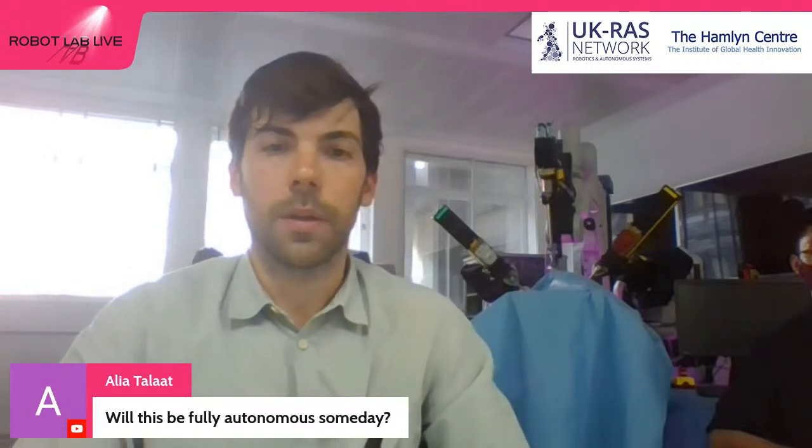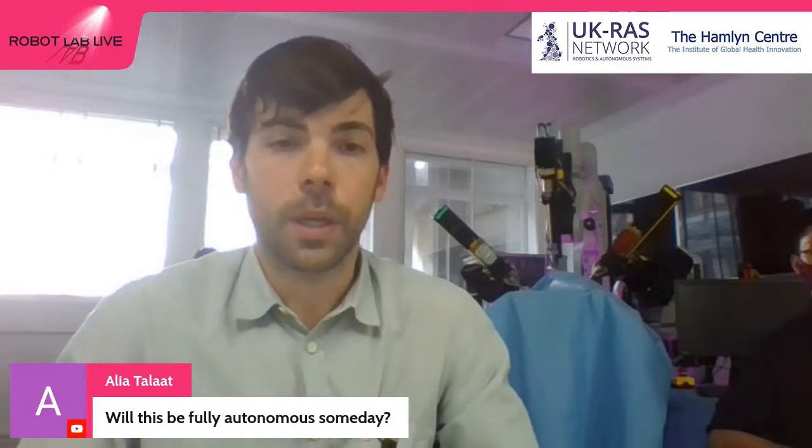So Ali is also asking if this will be fully autonomous someday, and our hope is that it will be, but we've been discussing that throughout the day. I think we are a long way from autonomous procedures, because we can do many things autonomously, but when it comes to surgery, it has to be 100% robust. There cannot be any flaw. So to get to that point, I think we are a bit far, but we can do some tasks autonomously with the help of vision and using artificial intelligence. That is very trending these days. So hopefully one day, but probably not in the next 5 years at least.